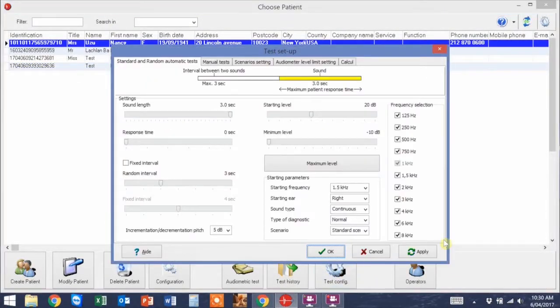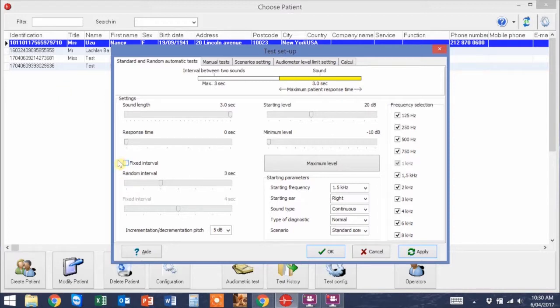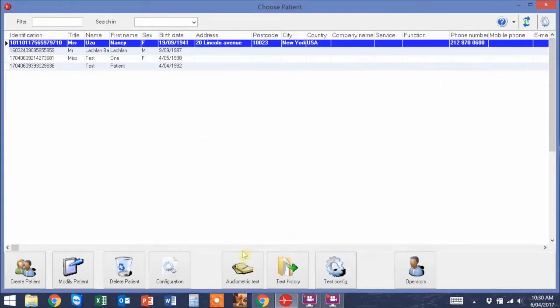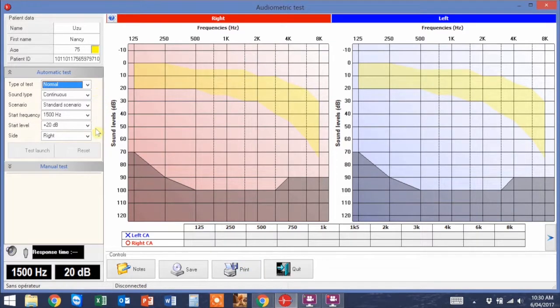Next, select test configure and decide whether you want it at a fixed or random interval. Once you have ticked or unticked the box, go and press into the audiometer. Now this is where you can change your settings on the left.